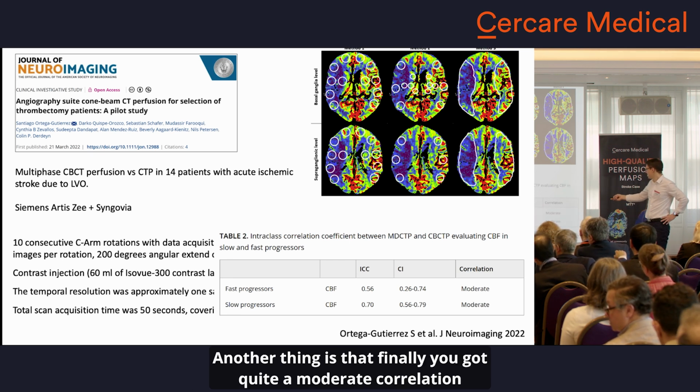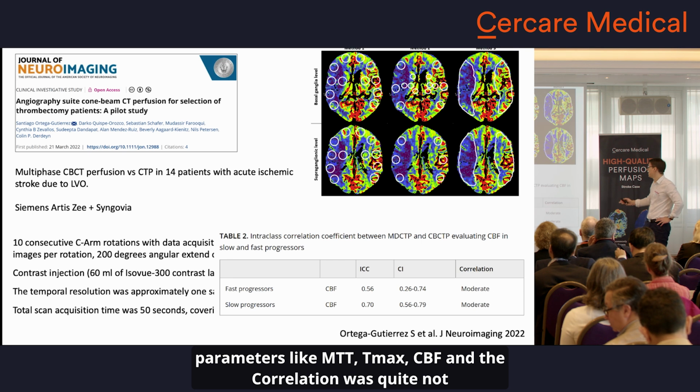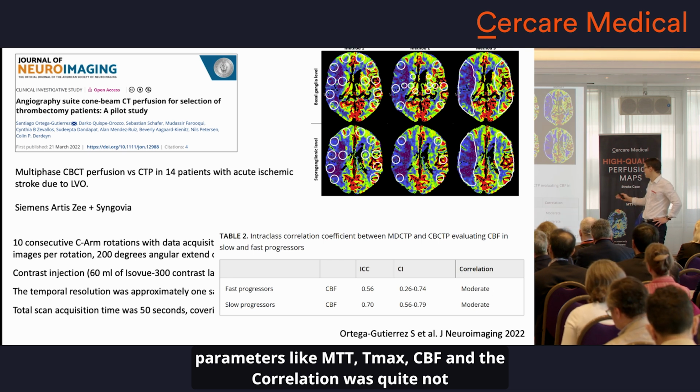And another thing is that you got quite a moderate correlation when you try to evaluate the basic parameters. It's really basic parameters like MTT, Tmax, CBF, and the correlation was not good enough.